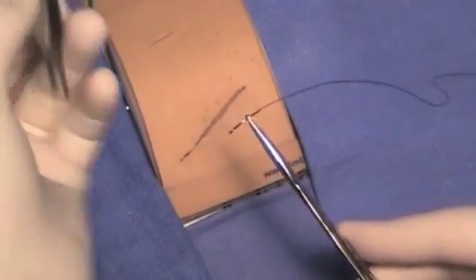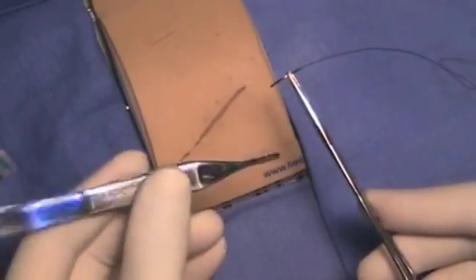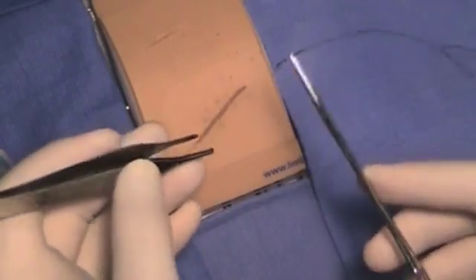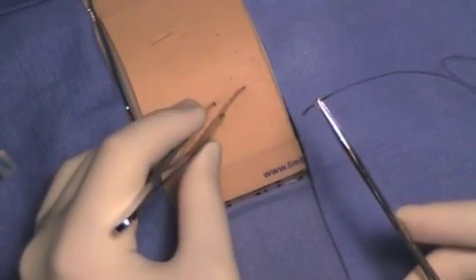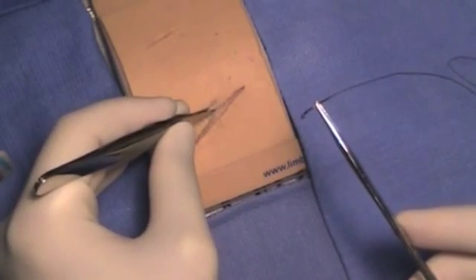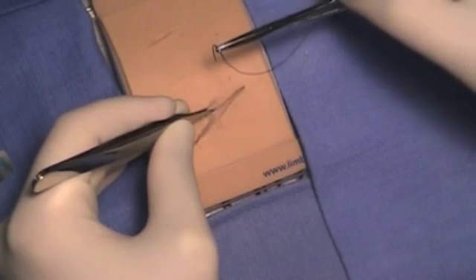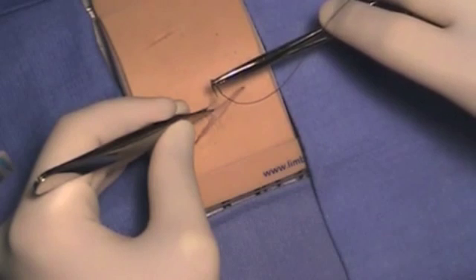Next, the student should be able to grasp the Atsons correctly with the thumb and index finger or thumb and middle finger. The student will be expected to know how to grab the skin edge with the Atsons to grab one layer and tent the skin up. Then the needle insertion should be done at a 90 degree angle to the skin.